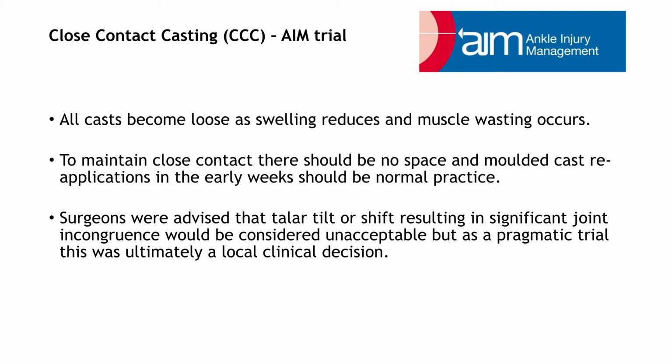Surgeons in the AIM trial were advised that talar tilt or shift resulting in significant joint incongruence would be considered unacceptable, but as a pragmatic trial, this was ultimately a local clinical decision.